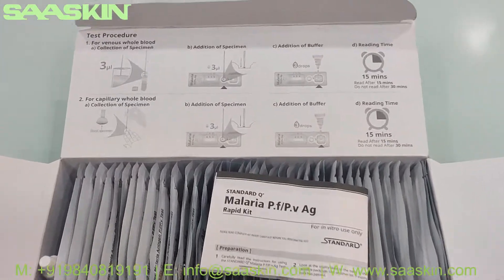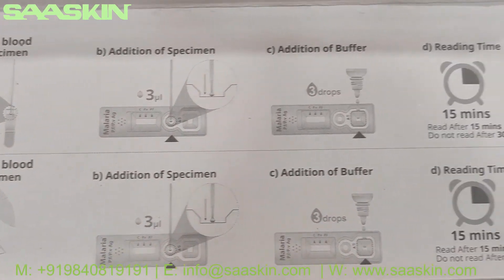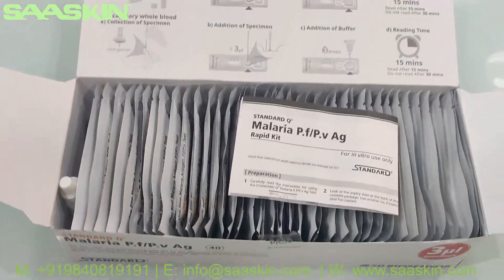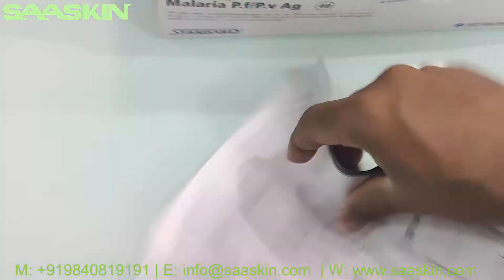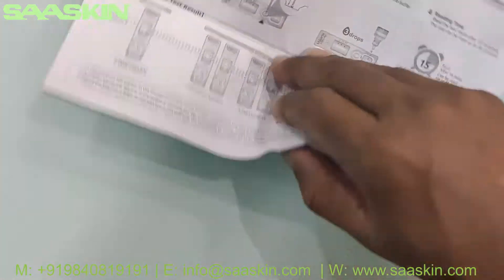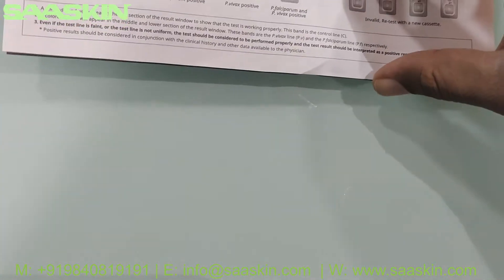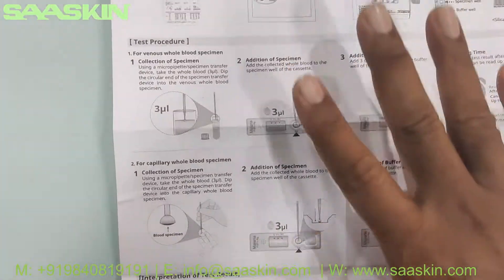This is how the box looks inside. On the cover you can see that the procedure is given. Inside the box we have the IFU brochure with the instruction manual. Let me pull this out for you. This is the complete brochure.